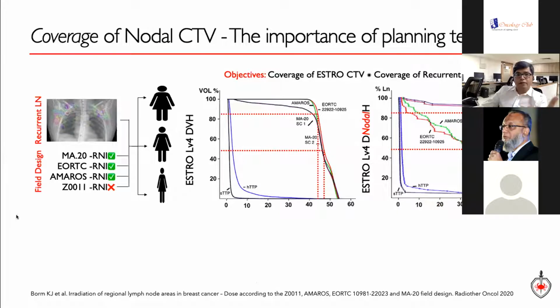And this is 2 or 3 more slides. I'm sorry if it's taking too long. This is probably important to understand because with early breast cancer, the study by Baum, which I showed you initially about the non-metastatic recurrent setting and upfront setting, took all those nodes and planned radiotherapy according to the 3 guidelines in early breast cancer, which demonstrated evidence of regional nodal irradiation, and also the Z0011 trial, in which there was no regional nodal irradiation. They registered both of these planning techniques to 3 women of varying builds.